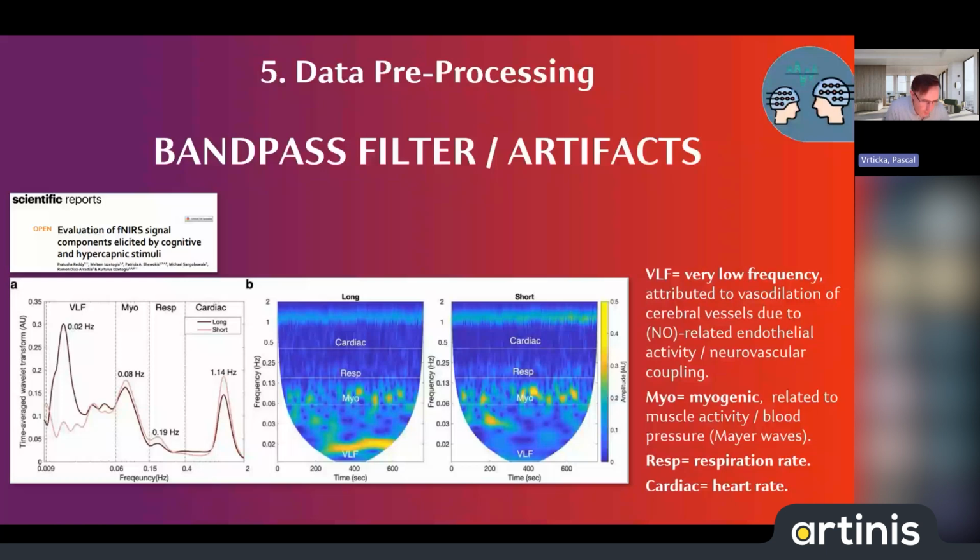And that's probably also quite important, because those are usually the frequencies that you want to look at when you analyze your fNIRS data for the tasks of interest. So whereas you can get rid of some of the noise when using short channels, it's not a perfect noise removal tool that works for all the frequencies with a similar efficiency.